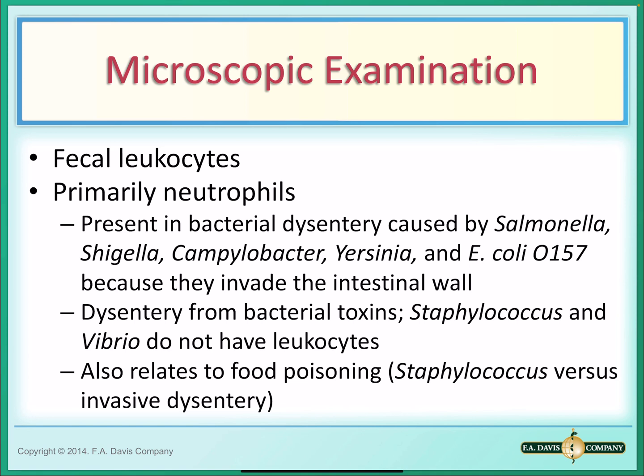Okay, so now let's move on to the microscopic examination of the fecal matter. One of the first things that we are going to do is inspect microscopically. Once you move on from analyzing the stool macroscopically, you're going to move on to do the microscopic testing. One of the tests that we do in the lab for the microscopic portion is the fecal leukocytes. We're actually looking for neutrophils, okay? These are a type of white blood cells.